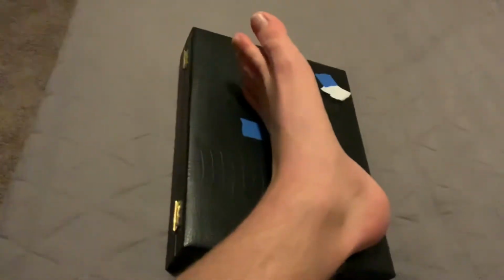So last we have the lateral view of the foot. Our patient is going to be in a 90-90 setup with the lateral surface of the foot resting on the cassette like this, knee at 90 degrees. Ankle should be dorsiflexed to 90 degrees.